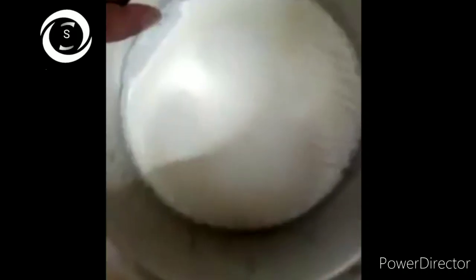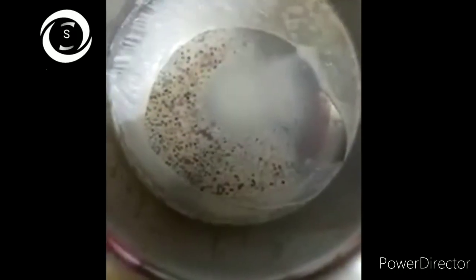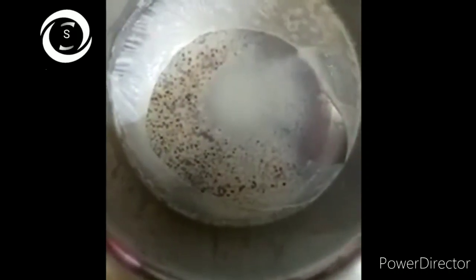You can see the superficial layer has been removed from the milk. Now the milk will be poured into another pot and we will be able to see how the capsulorhexis was done. Wow, what a great capsulorhexis has been performed on the milk! Thank you very much.